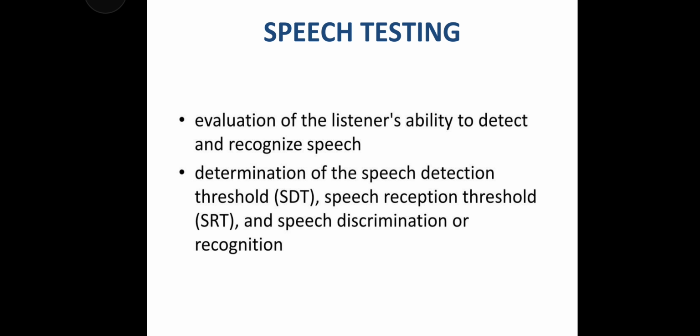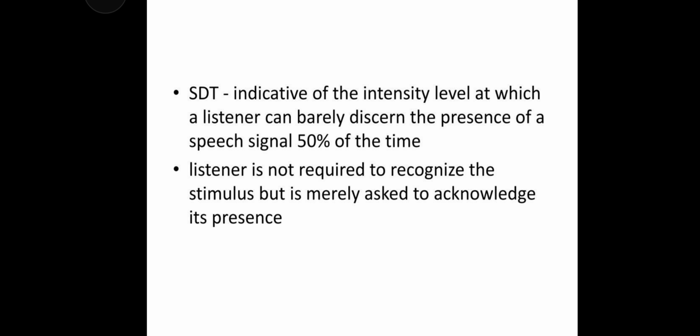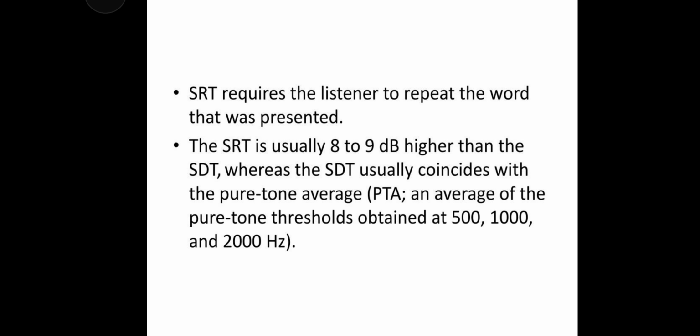Speech testing, evaluation of listeners' ability to detect and recognize speech. Determination of speech detection threshold, speech reception threshold, and speech discrimination or recognition. SDT is indicative of the intensity level at which a listener can barely discern the presence of a speech signal 50% of the time. The listener is not required to recognize the stimulus but is merely asked to acknowledge its presence.